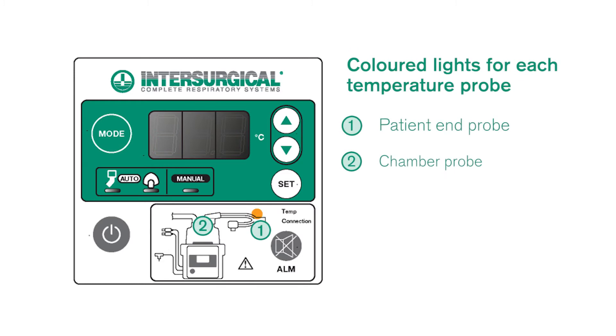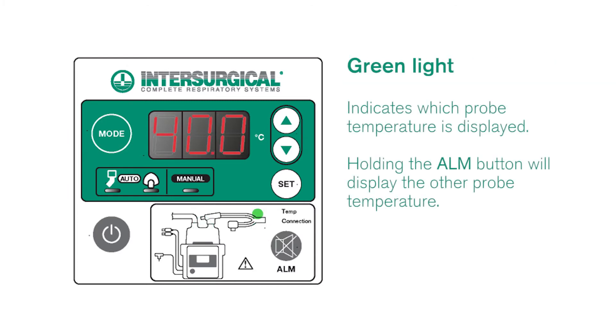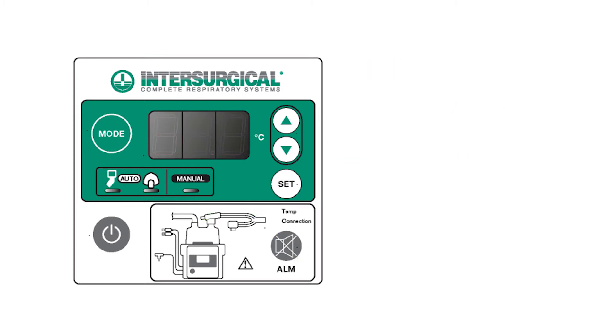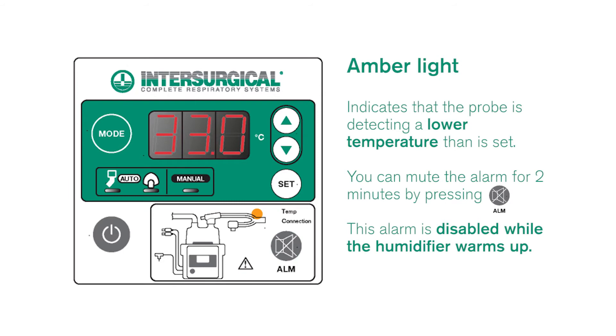The humidifier has colored lights for each of the probes. When highlighted green it indicates which probe temperature is shown in the display. This can be switched by briefly holding the alarm mute button. When highlighted amber the probe is detecting a lower temperature than is set. You can mute this alarm for two minutes by pressing the alarm mute button. The alarm is disabled while the humidifier warms up.